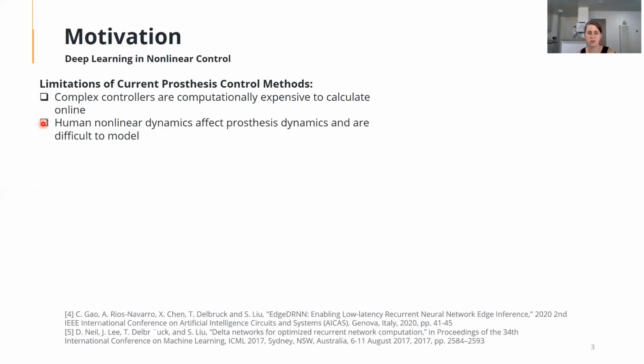Also, the human nonlinear dynamics affect prosthesis dynamics and are difficult to model, so this limits the type of controllers that we can use. To address these limitations, we investigated using recurrent neural networks, which Chang will now talk about.